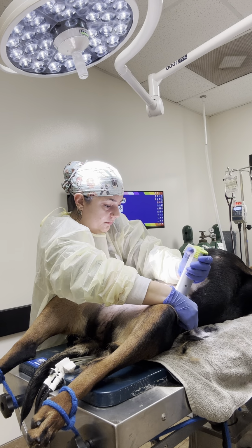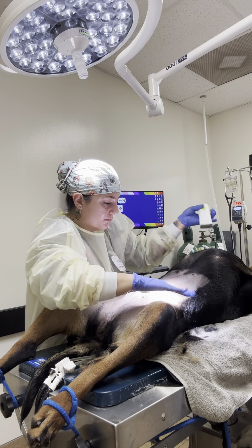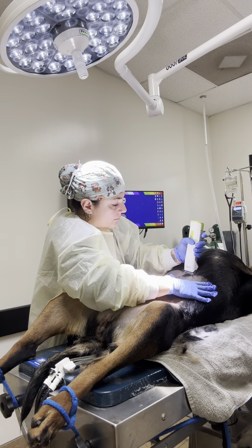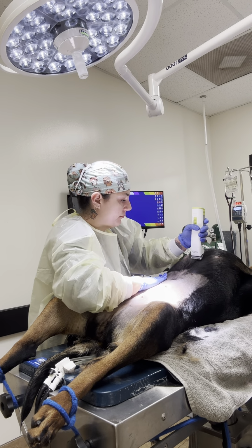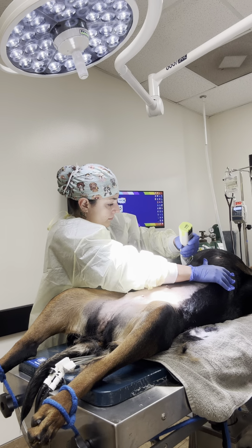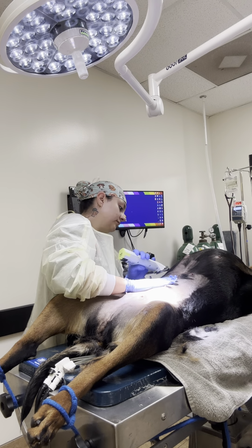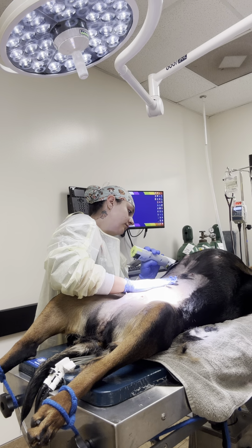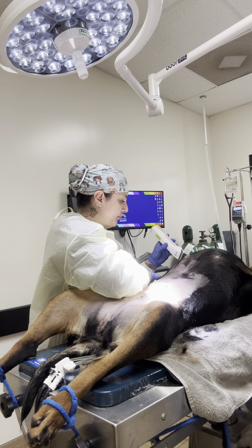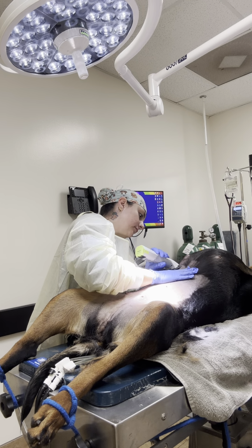Cool. So our MAP isn't unreasonably low, but we have a 50, which is on the lower side. So we do want more power coming from the heart. So now you have more information. Yeah. How fast does it work?